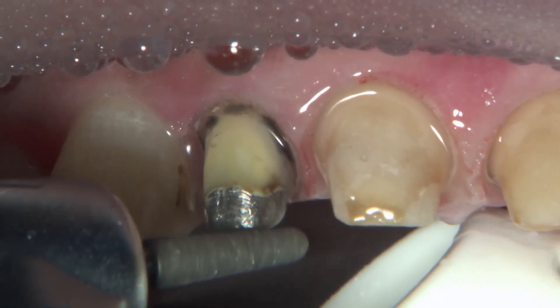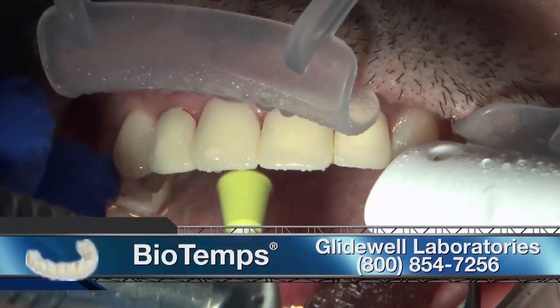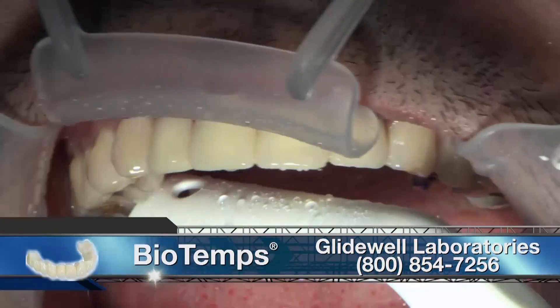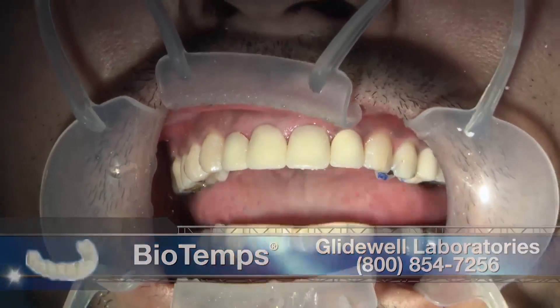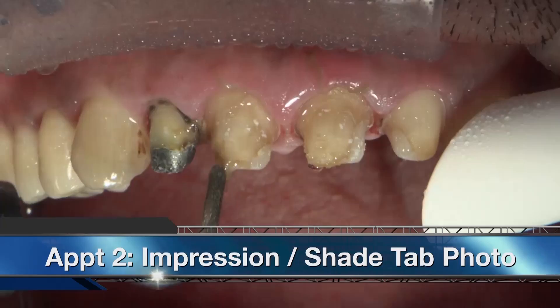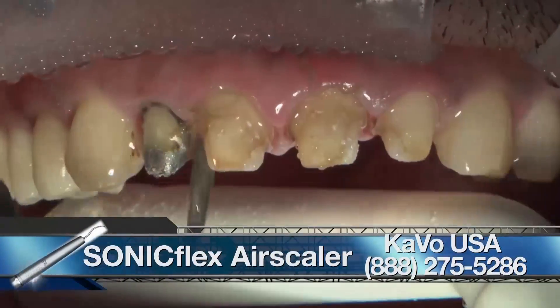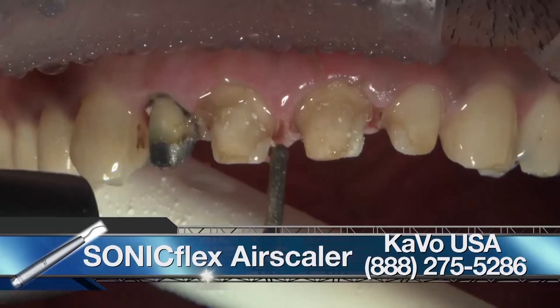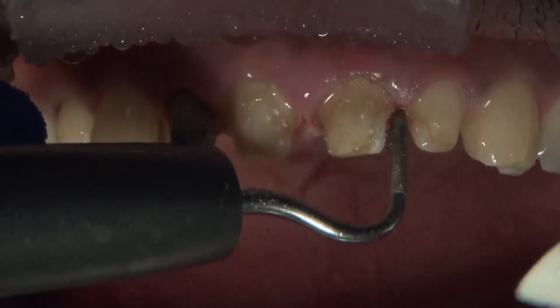Once we know we have enough reduction, we can go ahead and reline our biotemps, and the patient can go home with a set of temporaries. When the patient comes back for the final impression visit — if you don't do it the same day as the prep — the biotemps are removed. What I like to use, and what Dr. Mirsan used in this video, is an ultrasonic to remove the temporary cement. It's very helpful so you don't have to scrape away at the temporary cement.